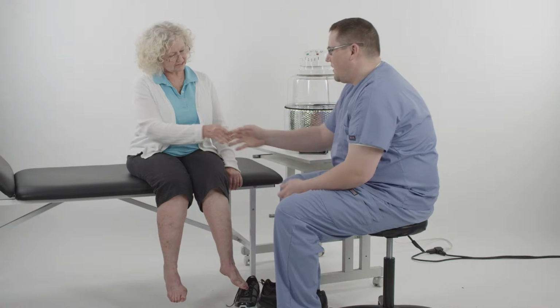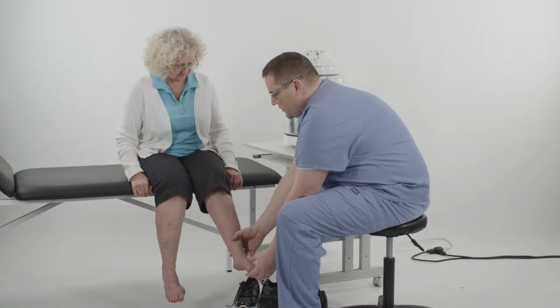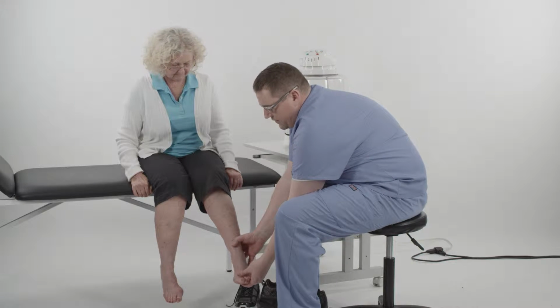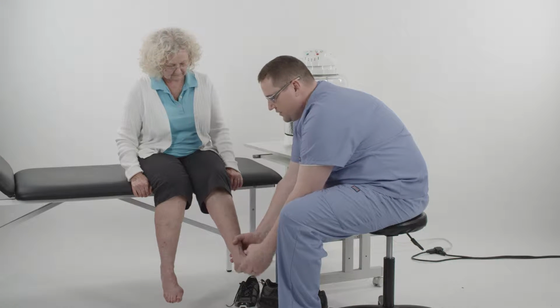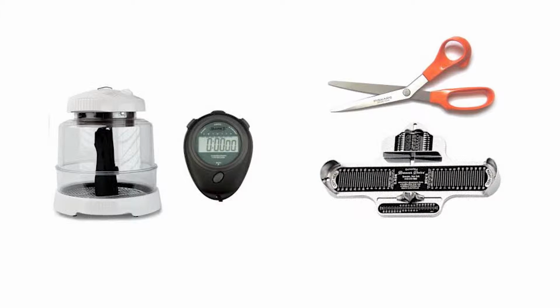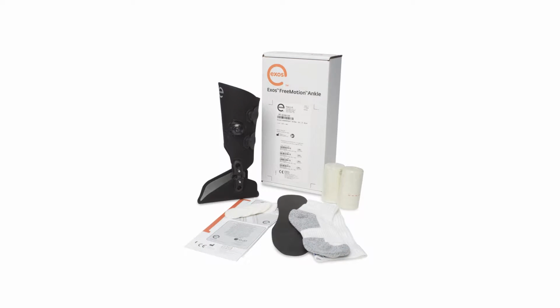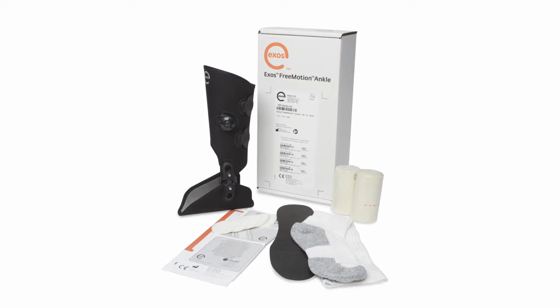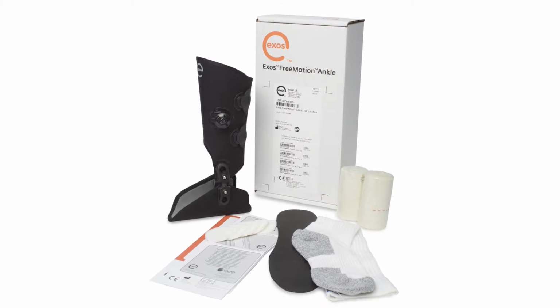Once the clinician has determined the necessary correction, check to make sure you have the proper tools for fitting the Exos free motion ankle brace. You'll need the Exos oven with extension rings, a stopwatch, and scissors. A brannock and long arm shoehorn are optional. A kit with 1 sock, 5 relief pads, and plantar surface padding is included with every brace.